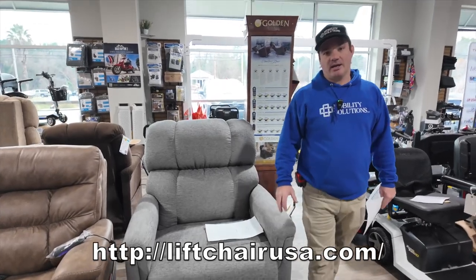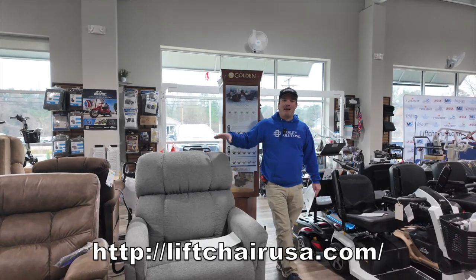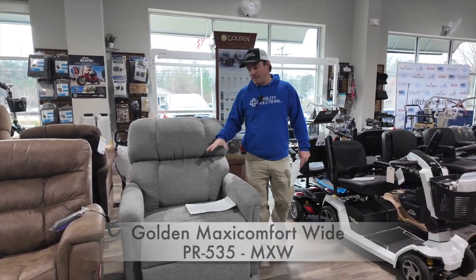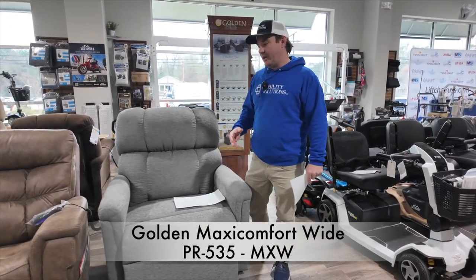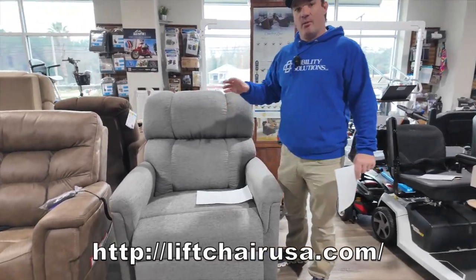Hey, I'm Chris with LiftChairUSA.com, Affordable Medical. I'm going to talk to you about a wide series Maxi Comfort chair, and I want to talk to you about this because we get a lot of people coming in here that need a little bit more independent adjustments when they're heavy.